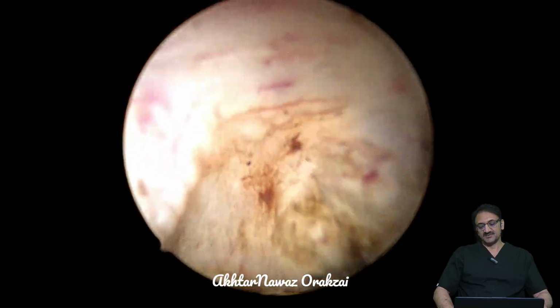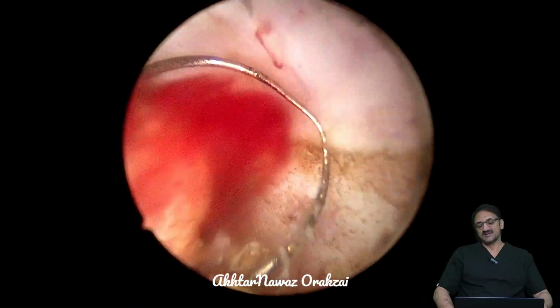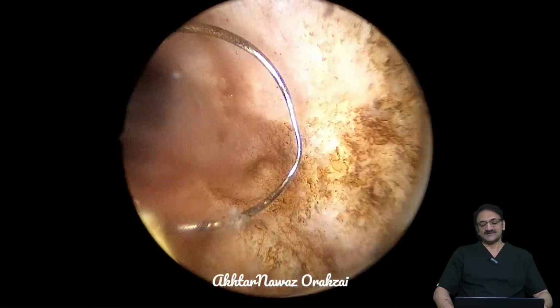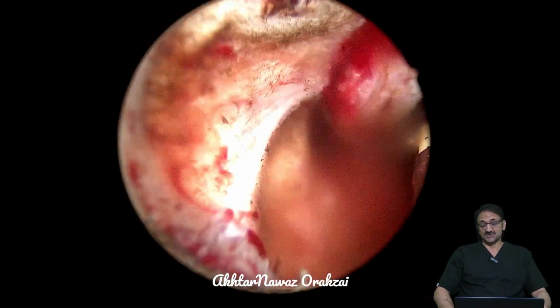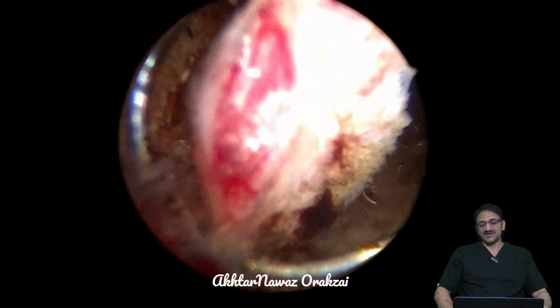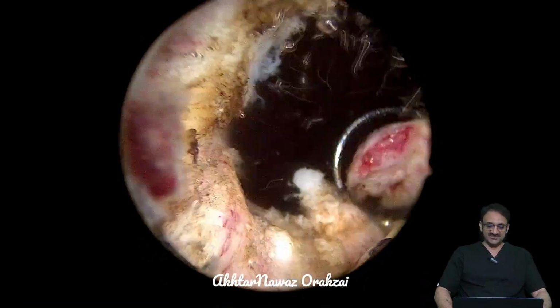Then we were thinking what to do, whether to perform a ureteroscopy, but we tried a method which is not shown in the books somewhere, and it was successful. We will see that by the end of the procedure.